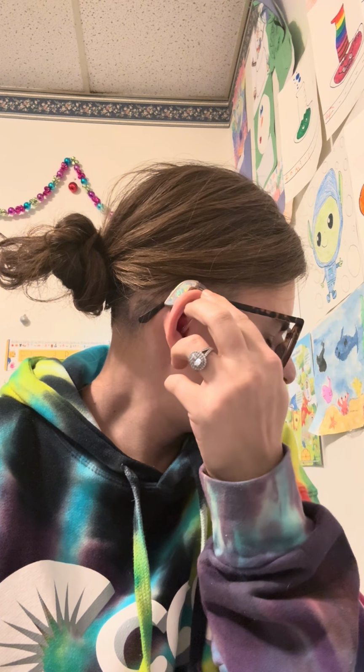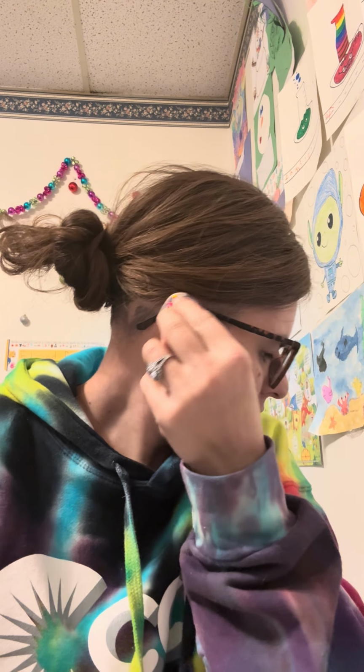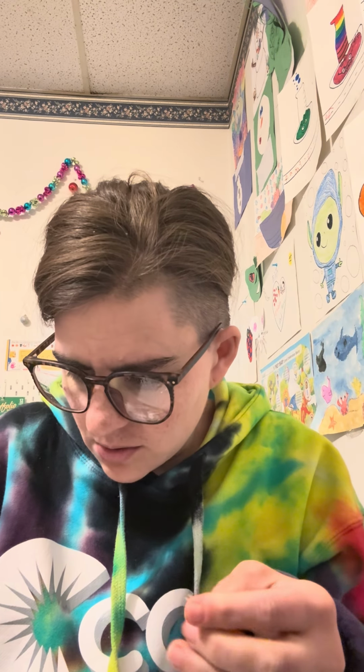The ear hook should be flush like this. So you see how it's up? Means I need to cut some more. So then you just take it off and you keep doing this until you have it flush.